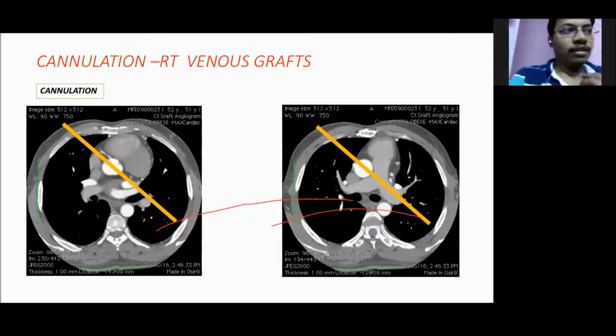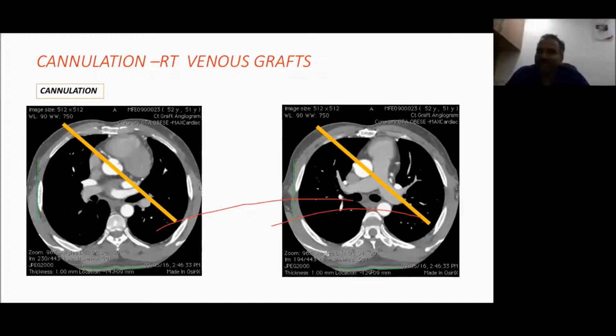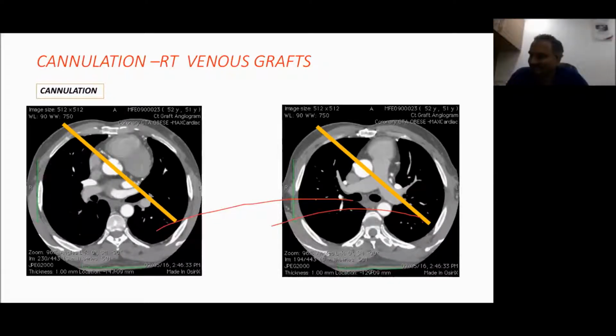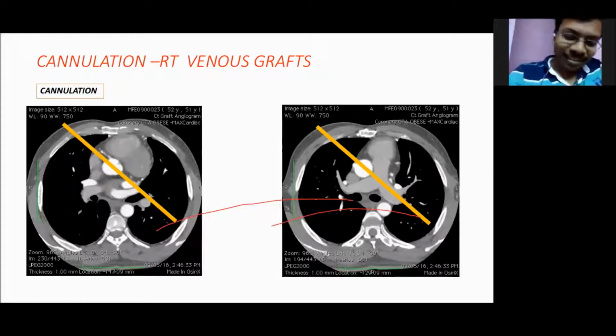Yes, sir. So in that, what did you do? You treated subclavian or you treated LMCA to LAD? LMCA to LAD stenting was done, sir. So we did not open the subclavian. It was a calcified ostial part. A CT aortogram was also done. It was calcified. The vascular surgeon also said it will be a very difficult and risky procedure. So we went ahead with the left main.